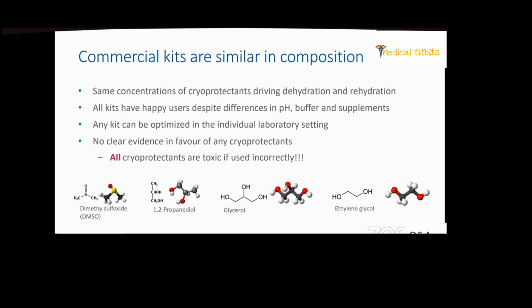Despite differences in pH buffers, supplements, and slight differences in terms of the protocols, all vitrification kits have happy users and can be optimized for individual lab settings. There's still no clear evidence in favor of one or other of the cryoprotectants. However, it's important to recognize that all cryoprotectants can be toxic if used incorrectly.